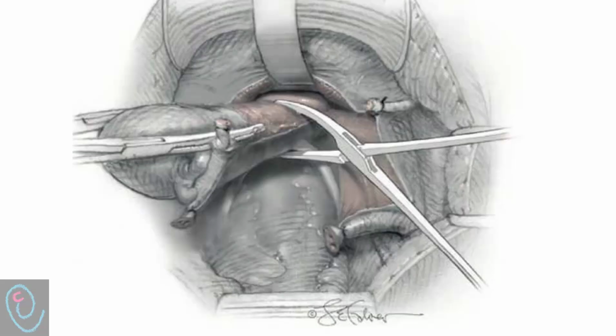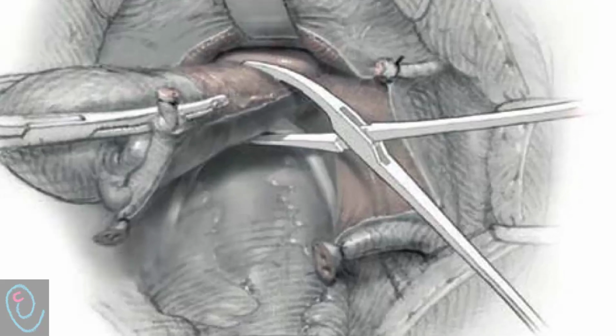Step 14. Vaginal transection. The surgeon hand palpates through the anterior and posterior vaginal walls to identify the most inferior level of the cervix. Then a curved clamp is placed across the anterior and posterior vaginal wall, just below the cervix on one side. This is repeated on the other side, and the tips often meet in the midline. The vaginal tissue above the level of this clamp is then transected. This frees the uterus from the pelvis.